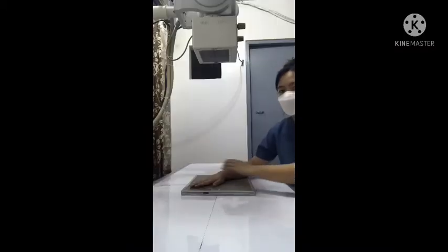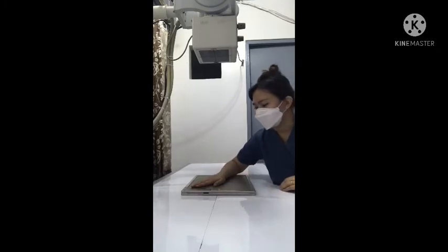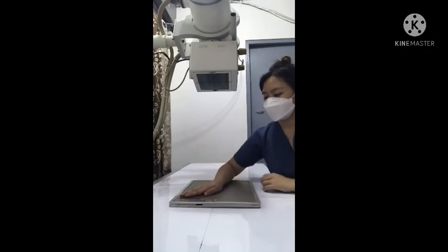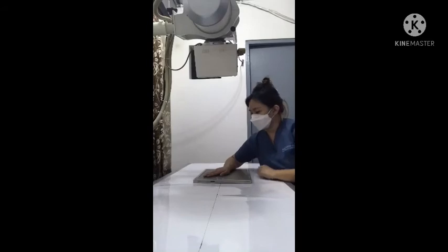I place my hand and forearm diagonally to the IR so that if I deviate my elbow towards the body, it will be parallel to the long axis of the IR. When we say distal angulation, the central ray is directed towards the fingers, and for proximal angulation, it is directed towards the elbow.